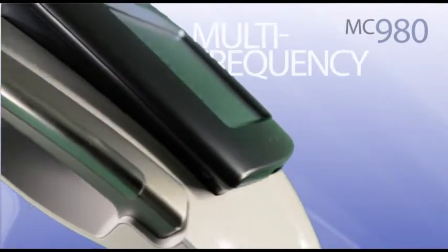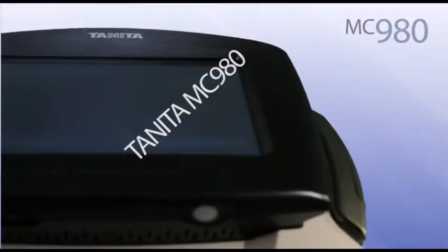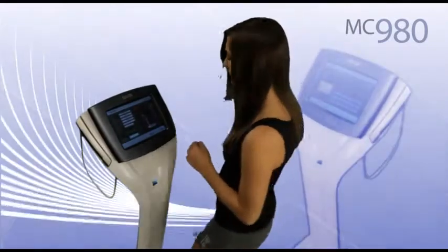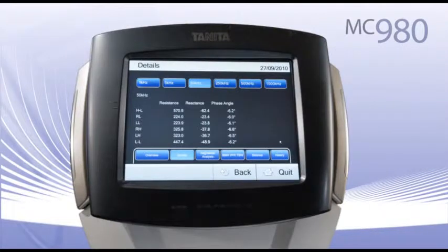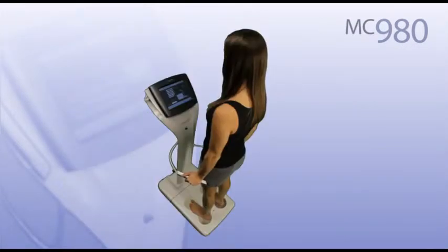With clinically accurate multi-frequency BIA technology, the Tanita MC980 Body Composition Analyzer sets new performance standards in body composition analysis. The eight electrodes use six frequencies to allow heightened accuracy to measure each arm, leg and the trunk area.